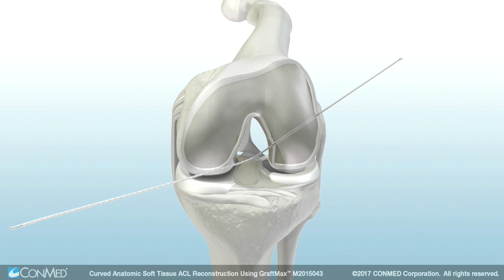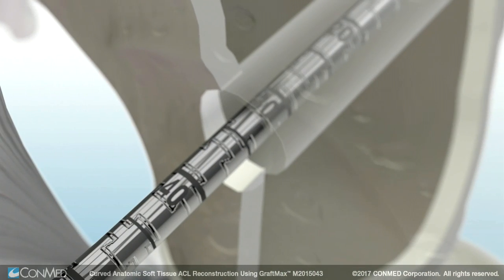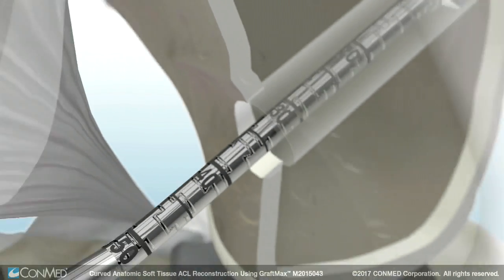Then advance the FlexExact pin out through the skin laterally. Next, insert the GraftMax FlexSentinel reamer over the FlexExact pin, keeping the cutting flute away from the femoral condyle. Advance the FlexSentinel to ream the femoral socket.